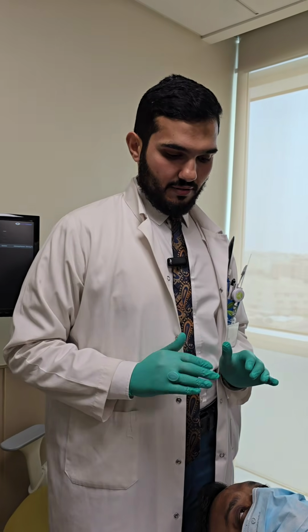Today we are explaining the technique of UBM, Ultrasound Biomicroscopy, which was first described by Pavlin and Foster in 1990. This is a high-resolution ultrasound which leads to detailed visualization and description of the anterior segment structures, mainly the angle. We will show the technique here.